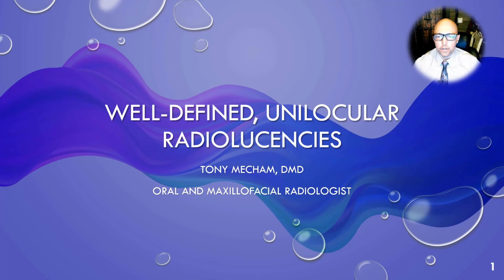Let's start getting into diagnosis. This is the first of the lectures getting into diagnosing lesions within the jaws. I have this course split up by differential diagnoses. So if you see some well-defined unilocular lesion within the jaws, whether the maxilla or mandible, you can start with this lecture. Download this PowerPoint if you haven't already. Hopefully this can guide you through a differential diagnosis to have an idea of where to start.